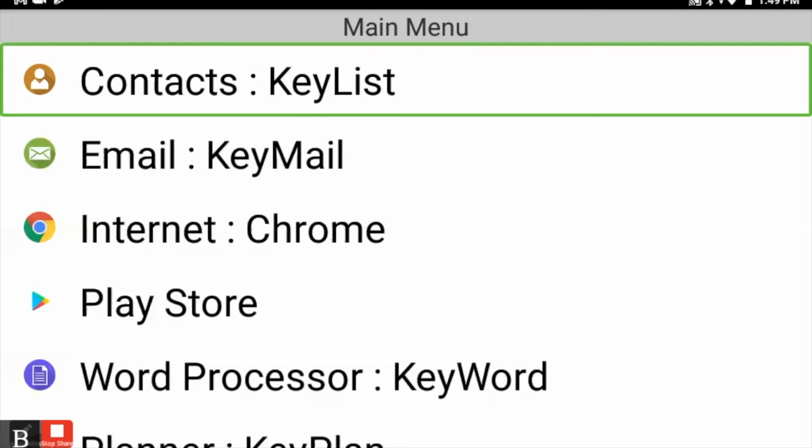And again, personal preference. Some of it's where your hands are already. For example, if your fingers are down reading the Braille display, sometimes it's easier to hit the thumb keys. But if you're up in the middle of typing or writing or something like that, then it might be easier to press the space bar or backspace, or the space and dot 4 and space and dot 1. So it's really personal preference, whatever happens to work for you, but it's basically multiple ways of doing the exact same thing.